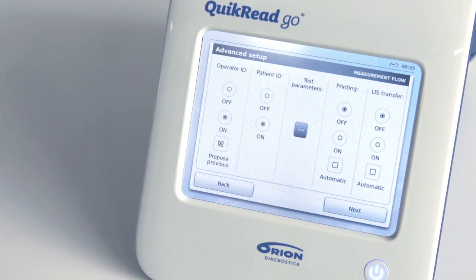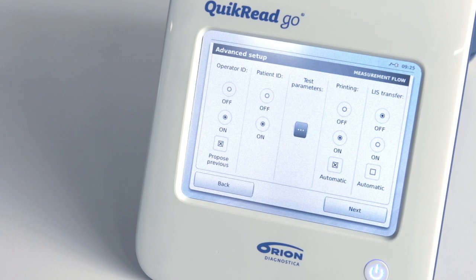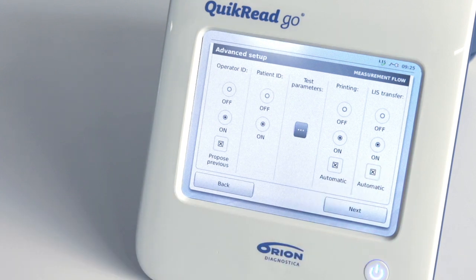In the same way, select Patient ID on if you want the instrument to ask for a patient ID before each measurement. By selecting Printing on, you can print each result by a manual command after the measurement is ready. If you choose Printing on plus Automatic, results are automatically printed as soon as they are ready. Setting LIS on allows you to send results to the laboratory information system by a manual command. If you select LIS on plus Automatic, the results will be sent automatically to the laboratory information system.